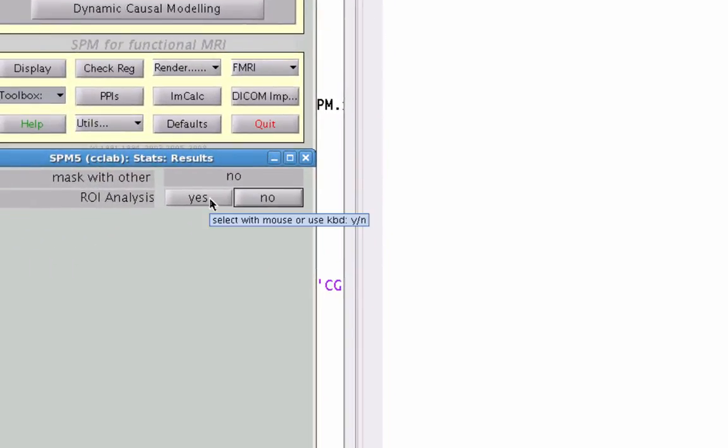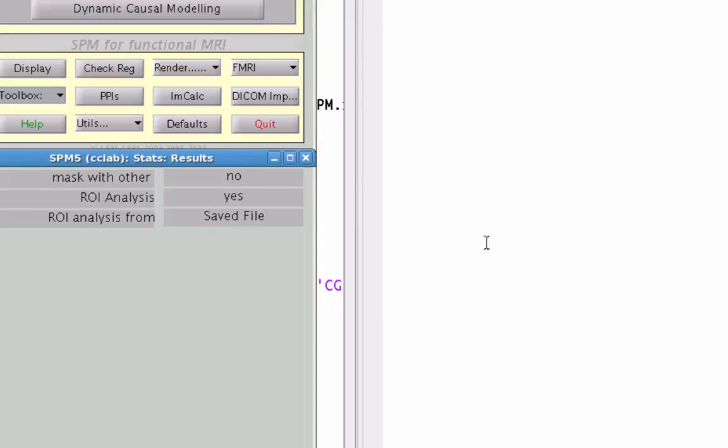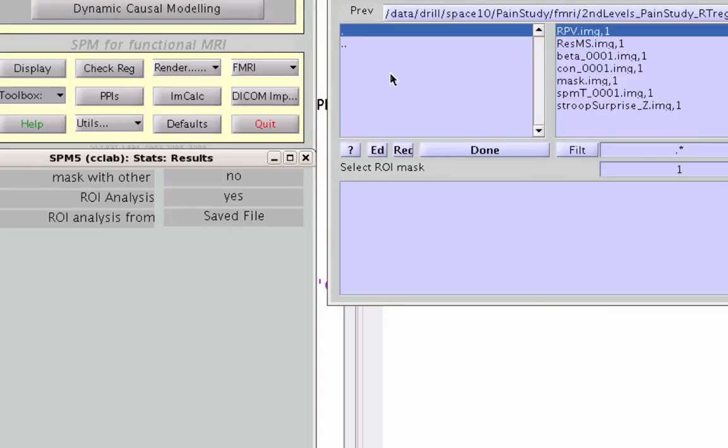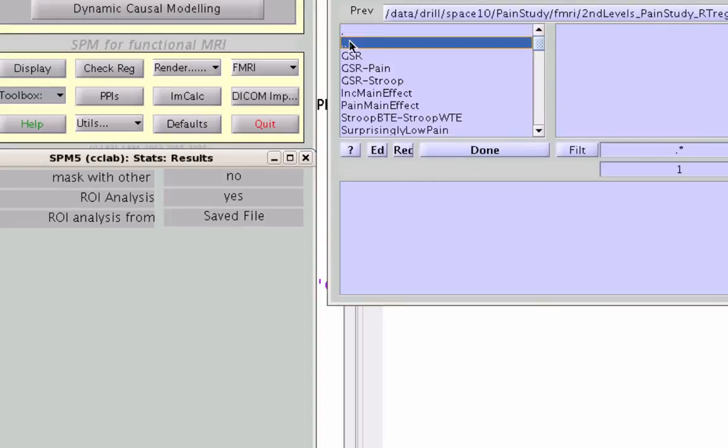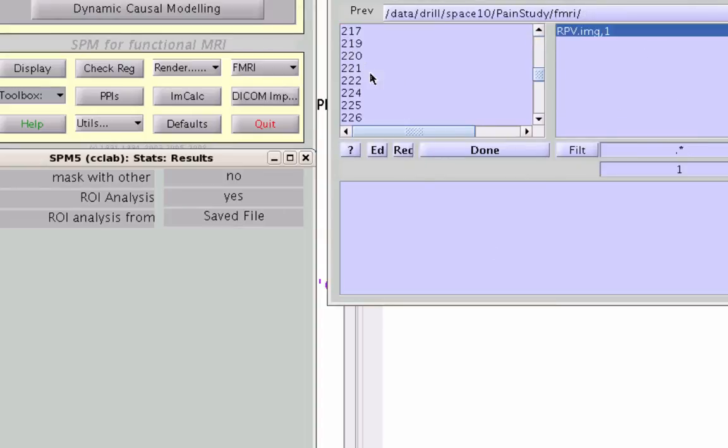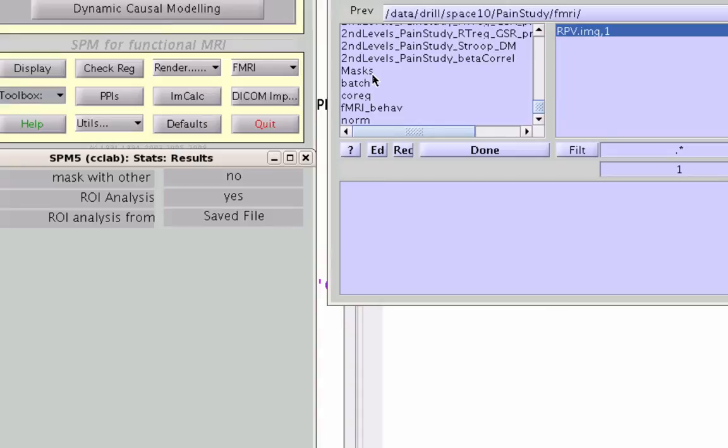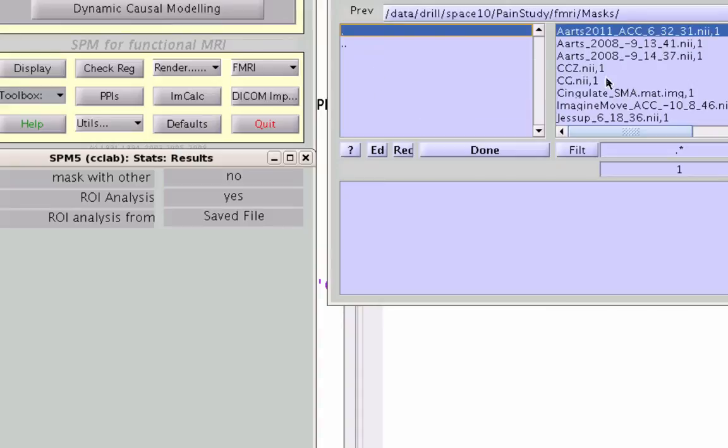What does matter is when you go to ROI analysis, select yes, and then go to save file. Go to where you've stored these files. Here I have it in a masks directory. And these are ROI .mat files, which have been converted to NIFTY format through MarsBar.